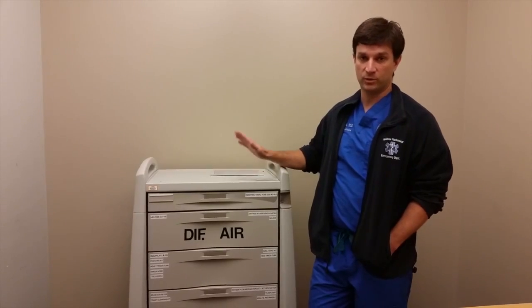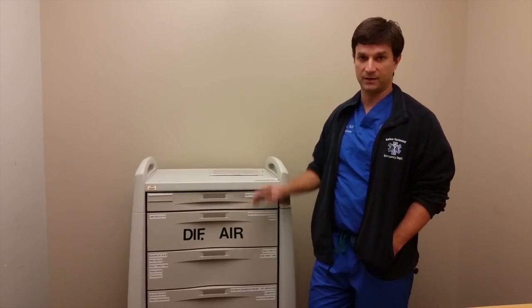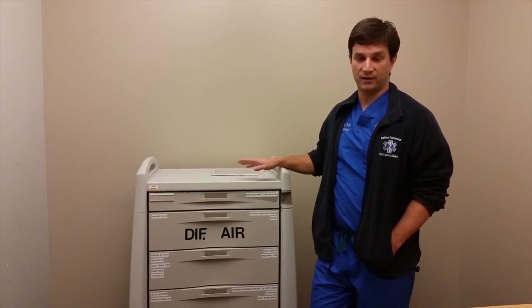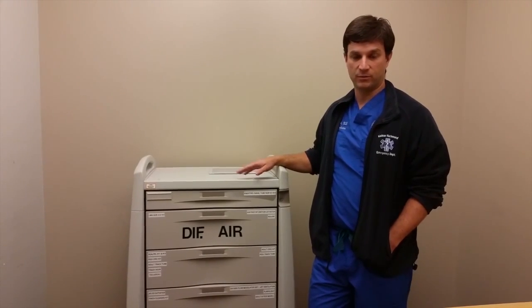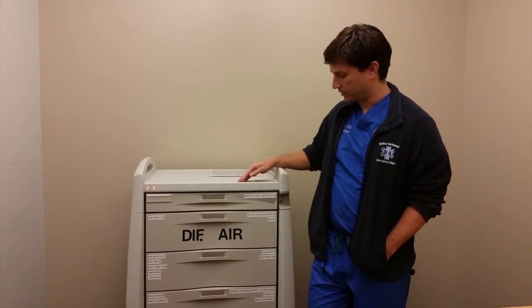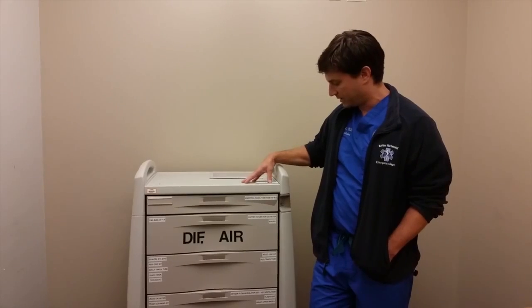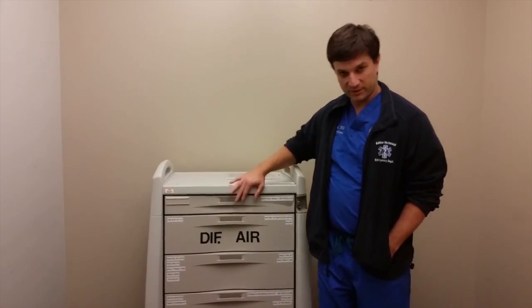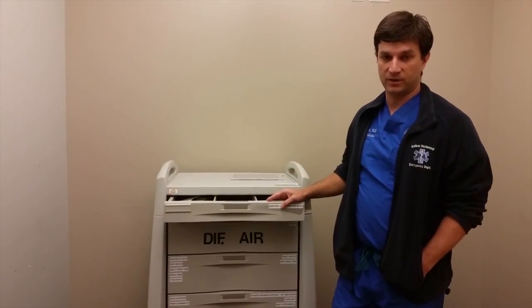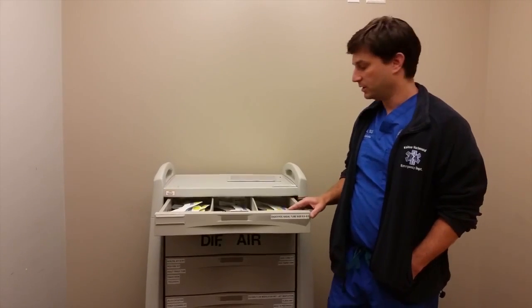So in that spirit, we've tried to centralize all our supplies in one cart, such that the operators, be it emergency or anesthesia, have ready access to all the usual implements that they would use in an algorithmic approach to a difficult airway. And in fact, the first drawer here deals with the situation where you've predicted that the person has a difficult airway even prior to attempting laryngoscopy or inducing a state of paralysis or sedation.